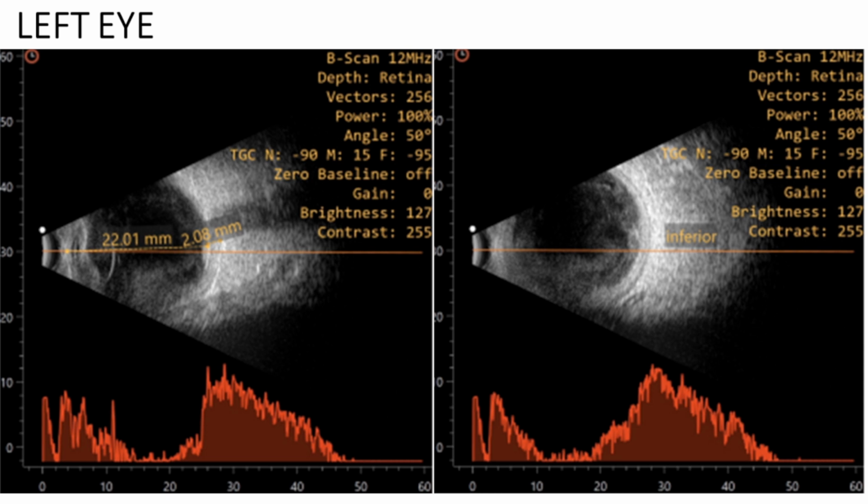there may not be, in this case, especially whenever there is a corneal pathology, when you see the ultrasound. If the echoes are distributed closer to the posterior coats, we may have to think more in terms of endophthalmitis. And sometimes you see a few echoes which are just anterior, just behind the lens or the IOL, which might be just reactionary, secondary to the corneal pathology. So this way you have to.